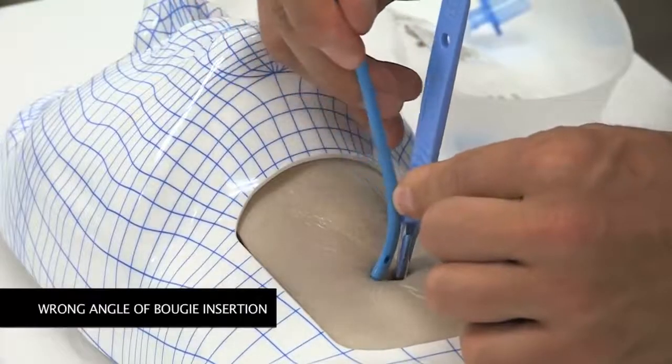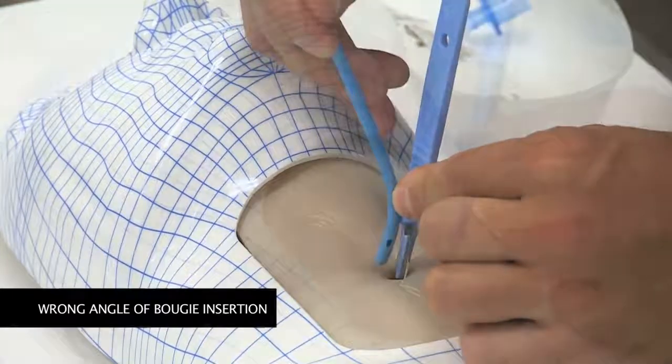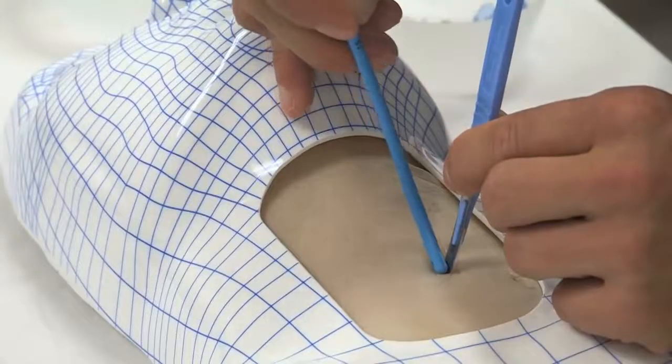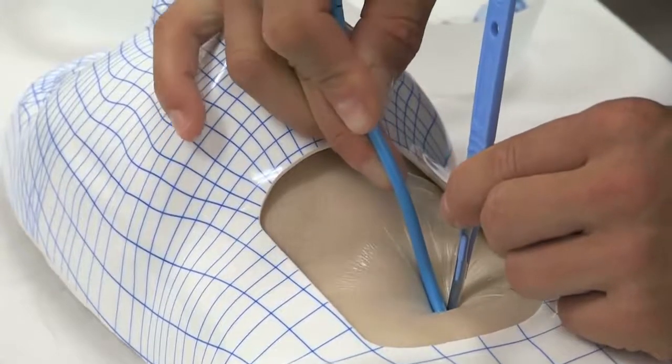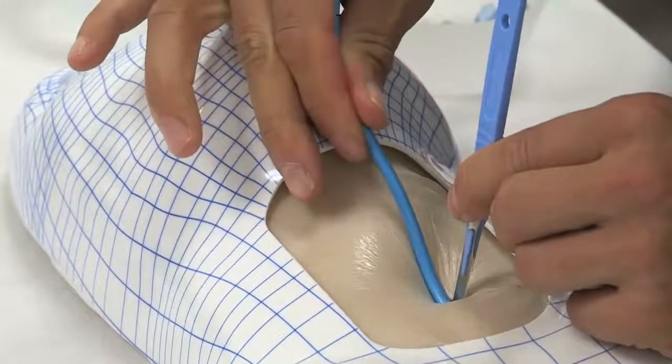Bougie insertion, other than in the horizontal fashion with the tip touching the scalpel blade, can make the bougie tip go into a paratracheal plane and may result in paratracheal insertion of the bougie.